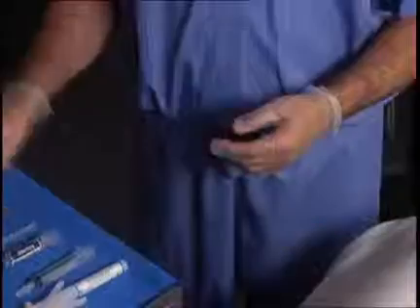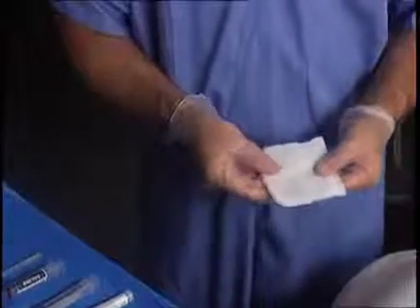The needle utilized to enter the space is a 3.5 inch spinal needle. For the conclusion of the procedure, it'll be necessary to have sterile 4x4s for cleanup, and then a simple Band-Aid will suffice to cover the entry site.